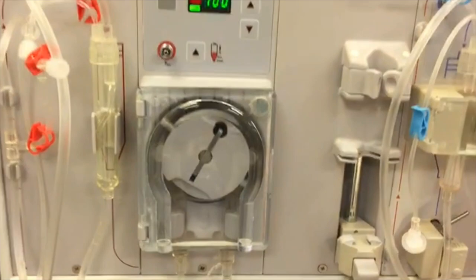This is what the machine looks like set up. It is priming right now. This right here is called our blood pump. It spins around and it keeps the blood circulating through.